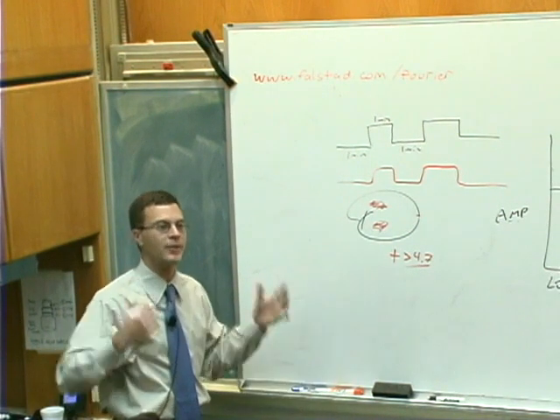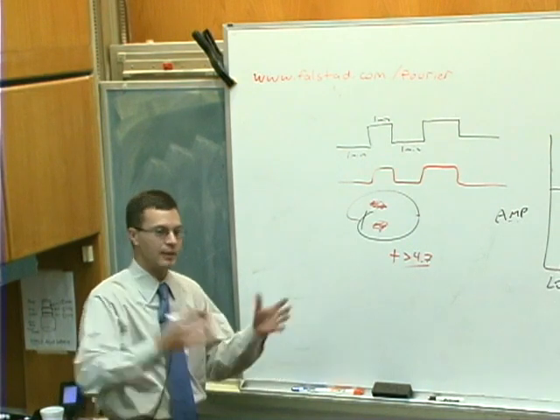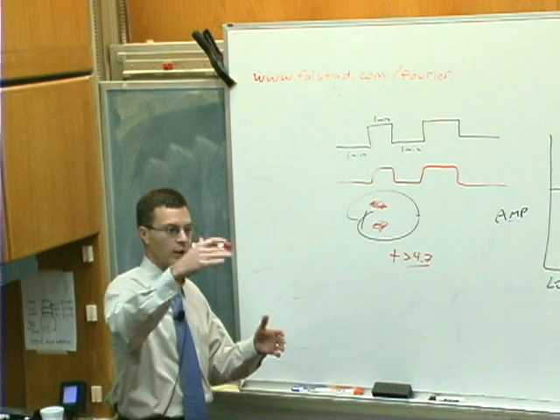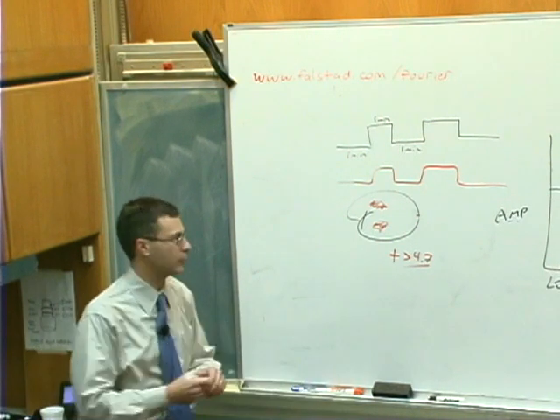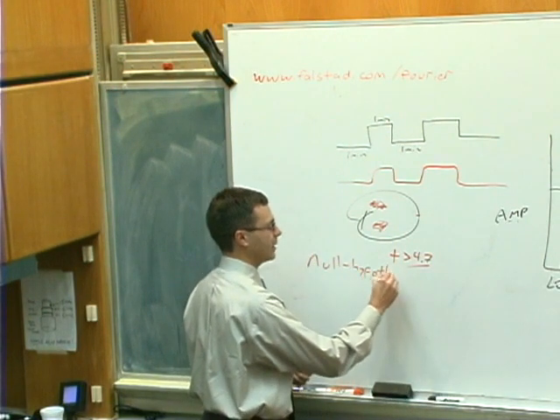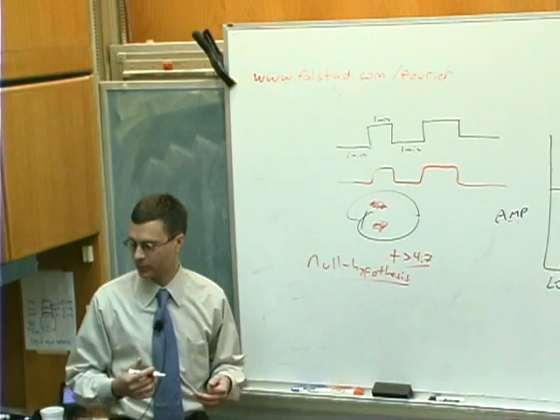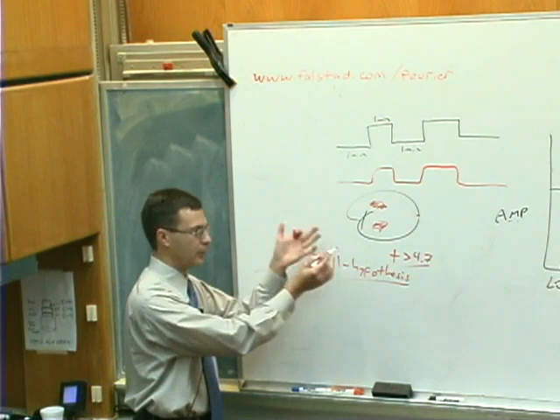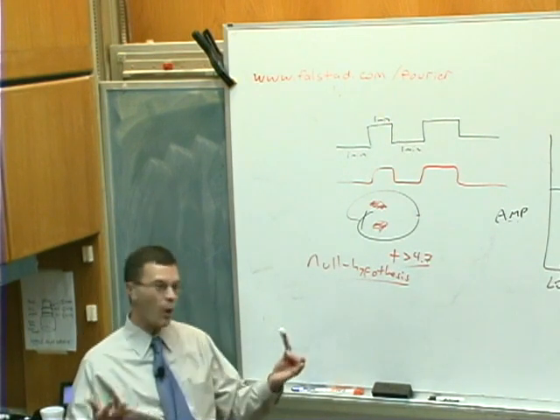In effect, these were data that were collected under the null hypothesis. Since I didn't present any stimuli, there really shouldn't be any difference between this one condition and the other condition, because no information was presented to the subject whatsoever. This is what's referred to as the null hypothesis. I would expect there should be no difference between these two alleged conditions. Yet nonetheless, there it is: a statistically significant difference in this map, even though there was no stimuli presented. So what could this be?